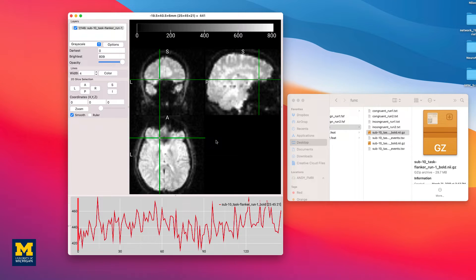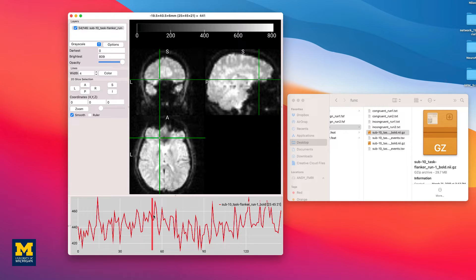You will also see a time series displayed at the bottom of the viewing window, representing the signal intensity for the voxel at the center of the crosshair. Clicking at a different part of the time series will jump to that volume, and the volume index will be updated in the Layers window. For example, 54 out of 146 means you are currently viewing the 54th volume in the time series out of 146 volumes total.